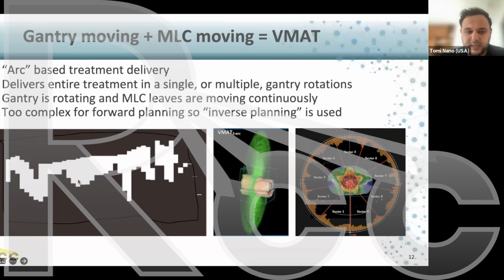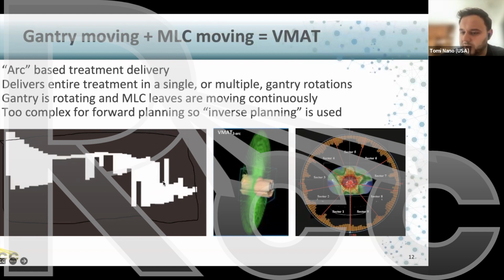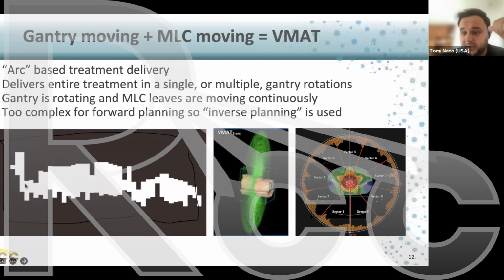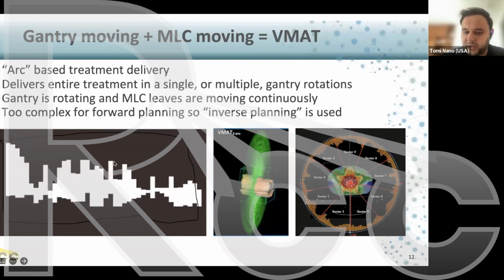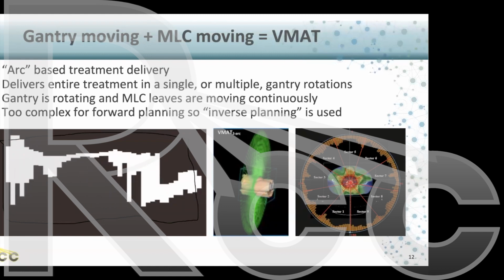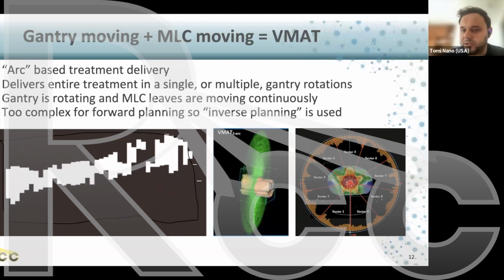But with IMRT, our opening is a bunch of these small parts, where the white part is. So we have to deliver 1 MU to this small part, and then another MU to this other small part, and then another MU to the other small part. As a result, our MU per dose increases, and it goes a lot higher.